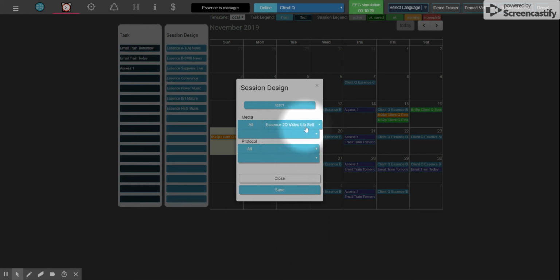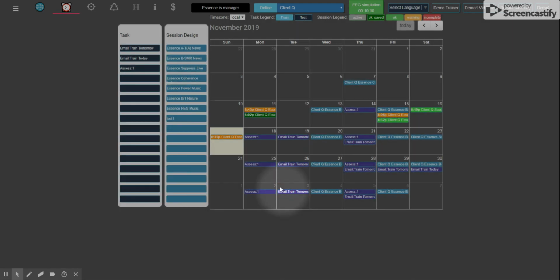Essence 2D Video Lib Self. There is only one media, it's test one. And similarly here for protocol, Essence EEG Lib Self, and there's only one in there as well, test one. And we save it. And there it is.